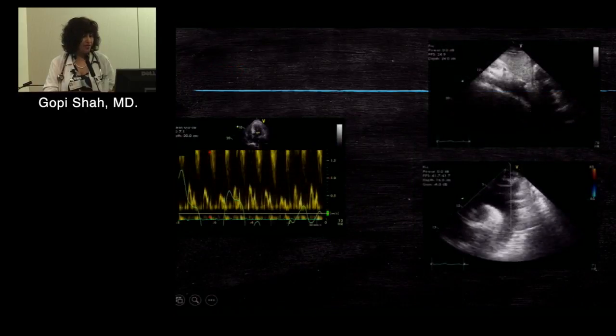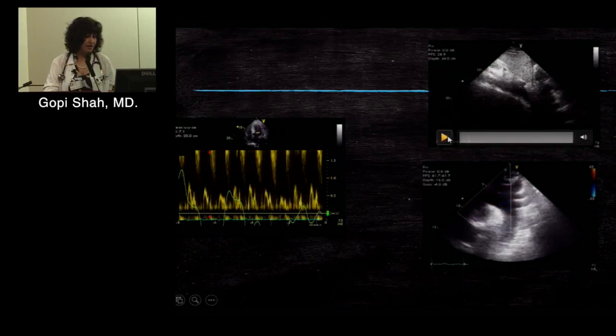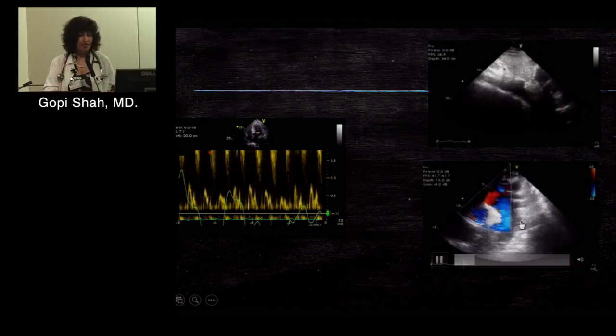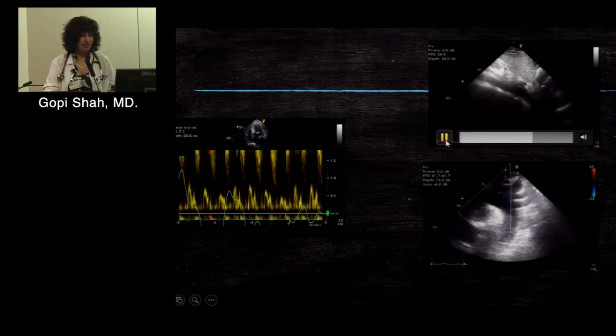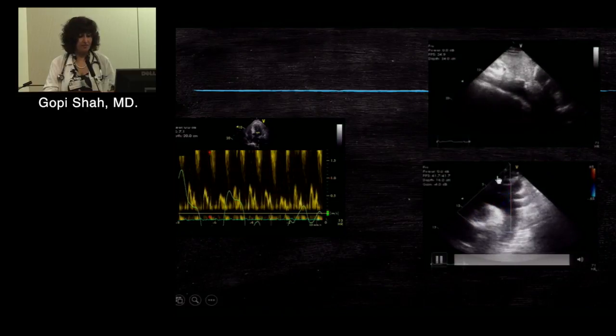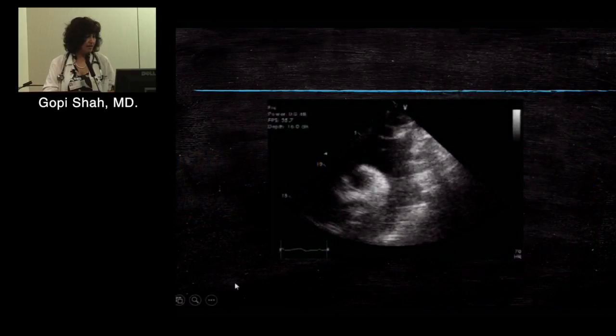And this is a patient who had come in with acute chest pain, and I'll play this. To be honest, if you're playing this, you really have to look very carefully. They're trying to image the descending thoracic aorta and aortic arch. The next view shows it pretty well.